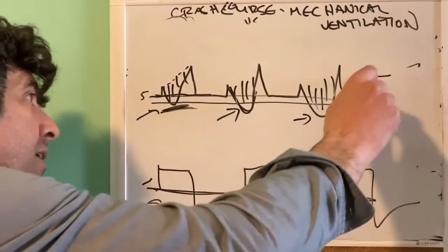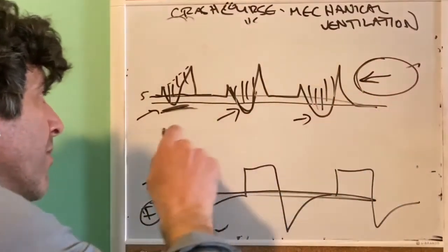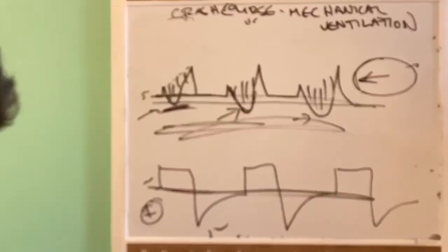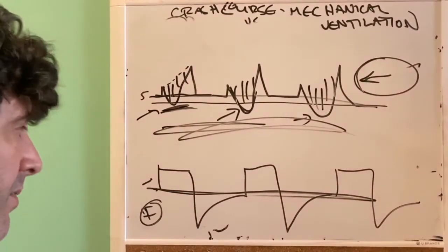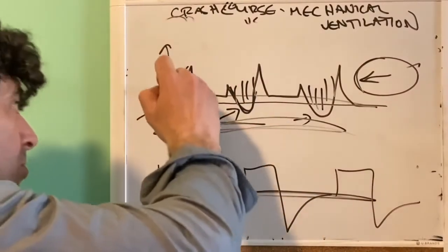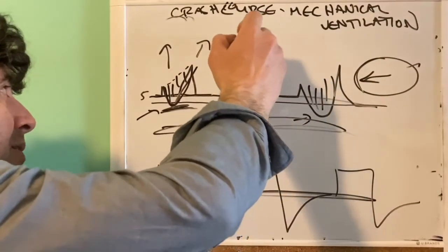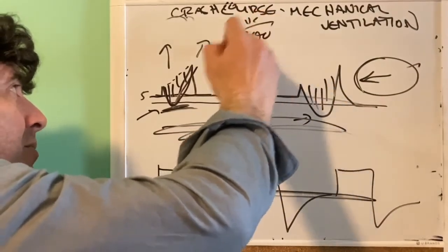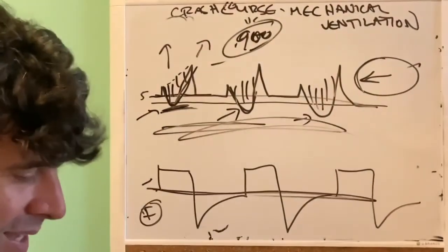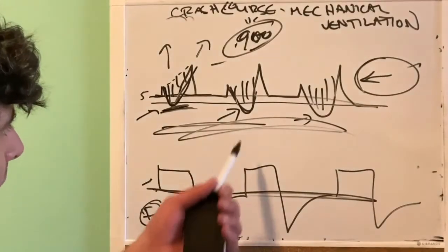What do you do with this patient? You have this patient who looks like this, who's performing a tremendous amount of work. Well, you can say, maybe this patient wants higher volumes, and so they're just trying to get more force to get higher volumes. Let's say if you put them on CPAP, they themselves would breathe 900. Someone who's breathing 900 on CPAP, you're not going to be able to easily fit them in a smaller volume box, and so you have to decide what's your priority.